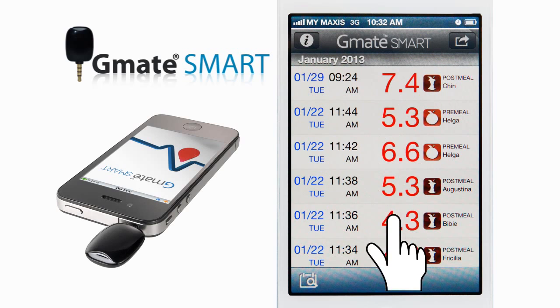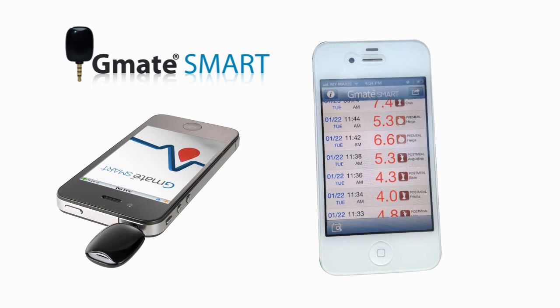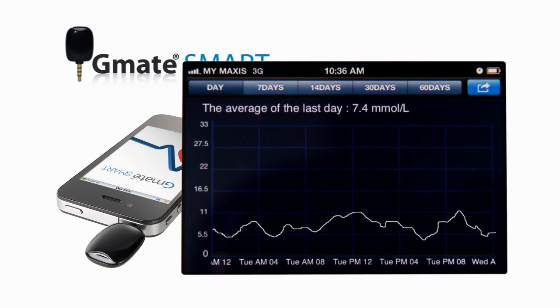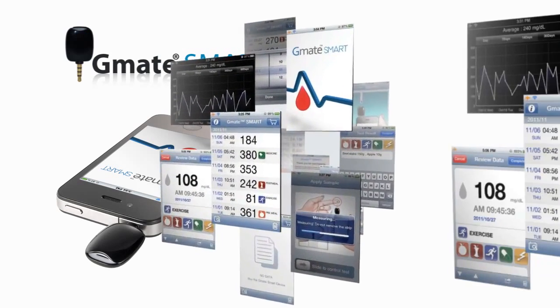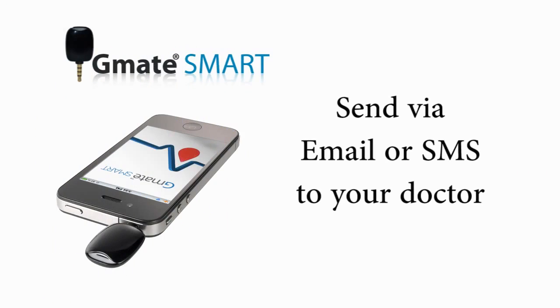Touch one of the results and detailed information will appear. When you rotate the smartphone horizontally, the results convert into a graph representing your glucose level. Touching the button at the top of the graph will change the zoom level and show the average of the last specific period. The application keeps track of all results and is even capable of emailing or sending SMS of the results to your doctor. Now you can say goodbye to your logbook.